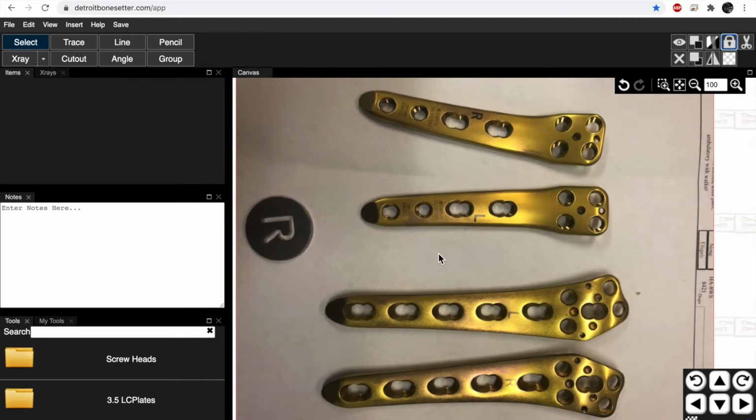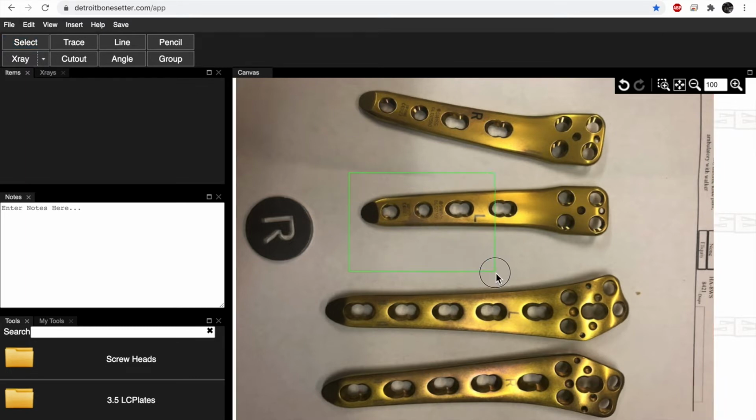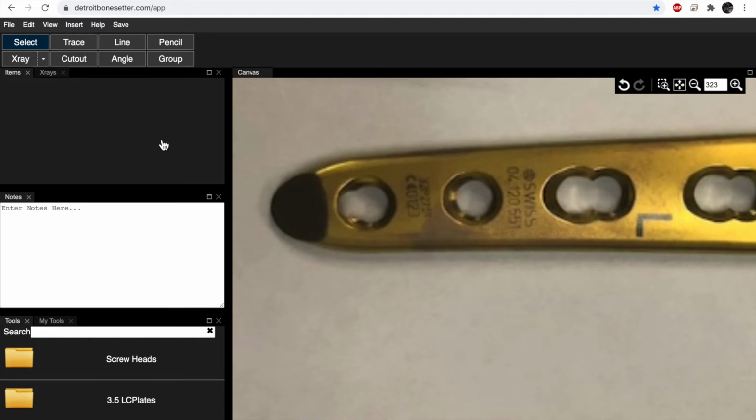I'm going to pick one of the implants. Let's pick this one. And this is a Tomofix medial femoral plate. I'll make it a little bit bigger, so I'll make it big so I have very accurate. And then I'm going to go to cut out. And I'm going to cut along the edges of this implant.